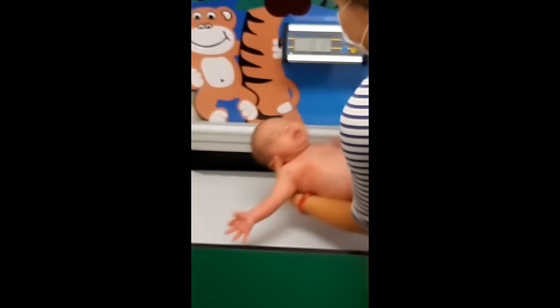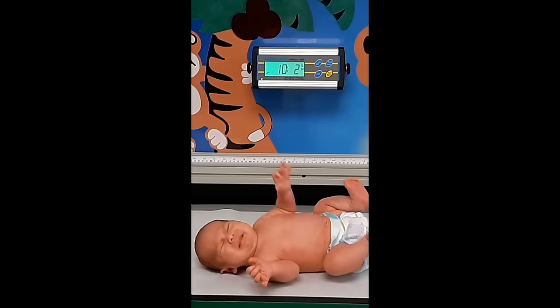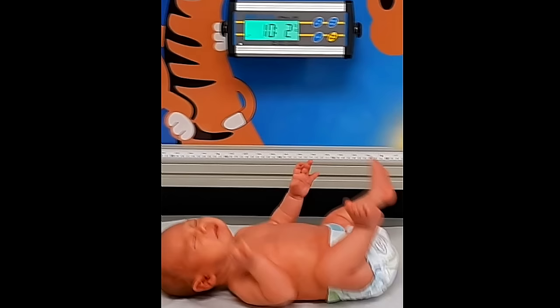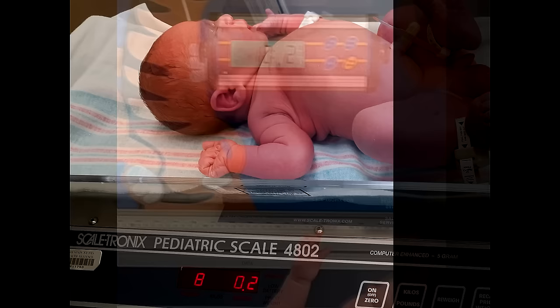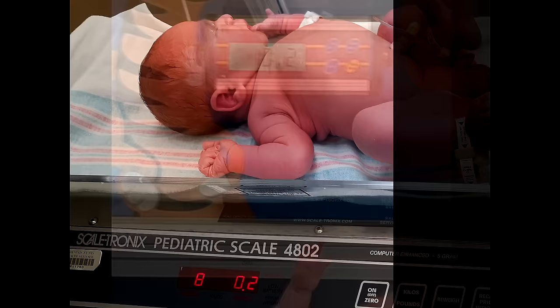To obtain a weight on an infant, you want to remove the infant's clothing and any soiled diaper — a dry diaper can be used. Place the infant on the scale and obtain the weight. This infant weighs 10 pounds, two ounces, so you'd want to document that weight and then look at the infant's previous weights. This patient weighed eight pounds at birth, and now at this two-week appointment they weigh 10 pounds, two ounces — that is a very good weight gain from their birth weight.